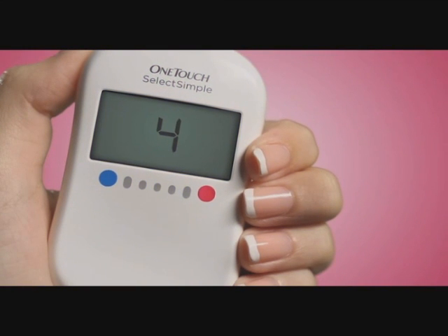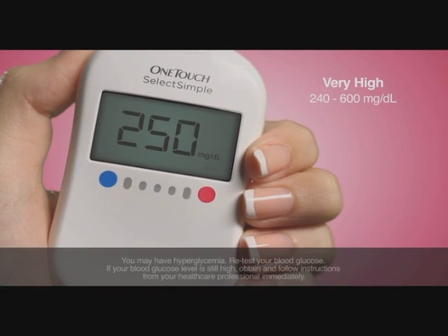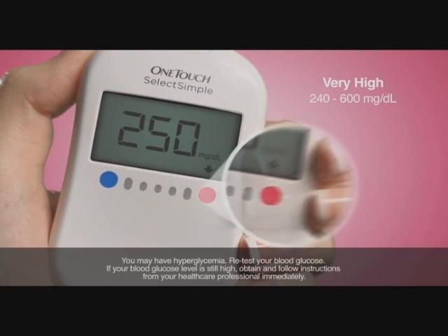If your blood glucose level is 240 milligrams per deciliter and above, you'll see a flashing arrow point to the red dot and hear an alert.